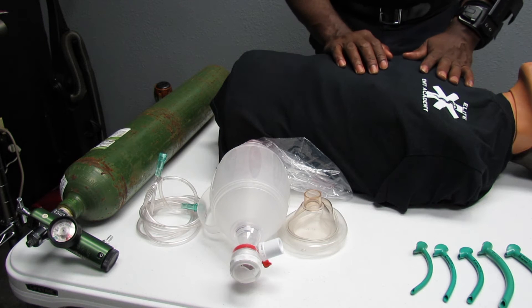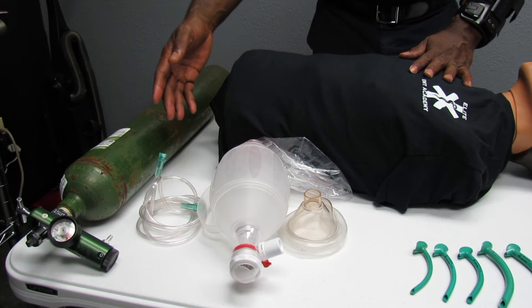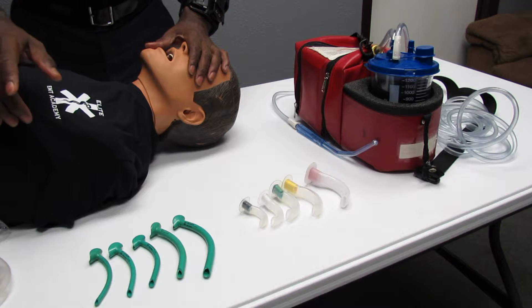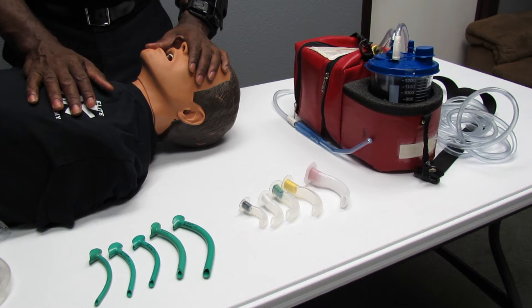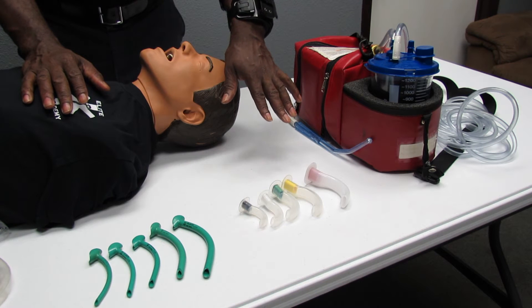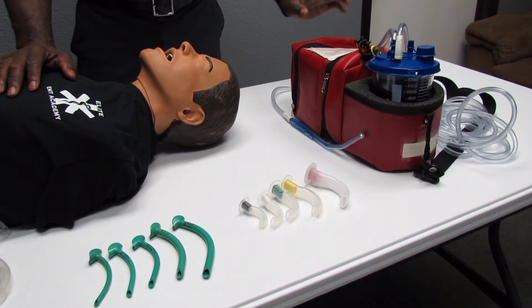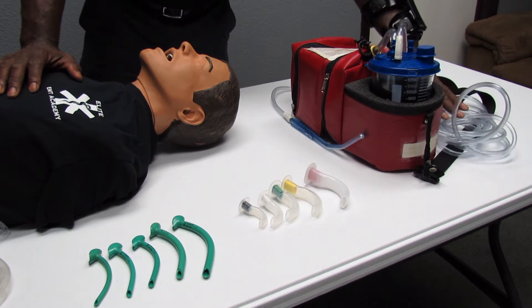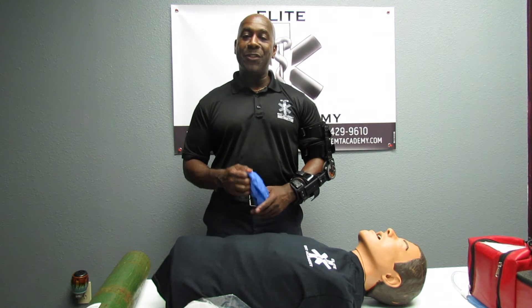For this skill you will need the following equipment: a full oxygen bottle with a regulator attached, oxygen tubing, a BVM with a face piece. Nasopharyngeals of different sizes so you can measure and select the right one. Oropharyngeals of different sizes as well. Properly functioning suction equipment including your canister, suction tubing, and your Yankauer. Take or verbalize the appropriate body substance isolation precautions.